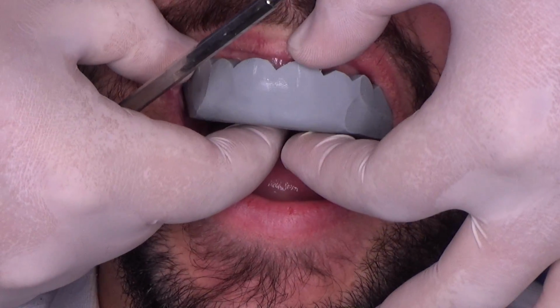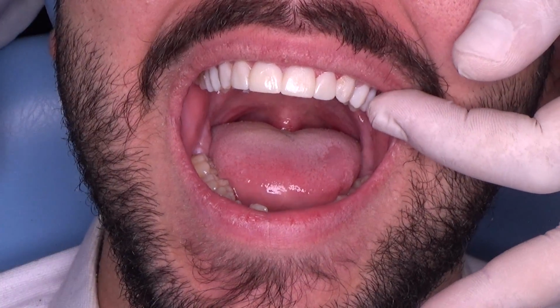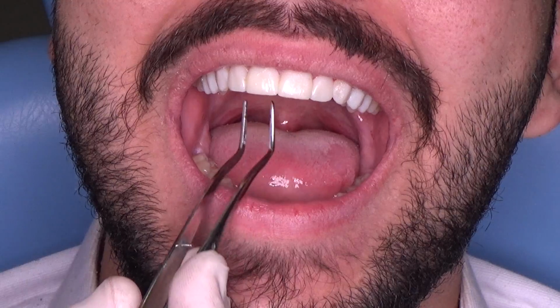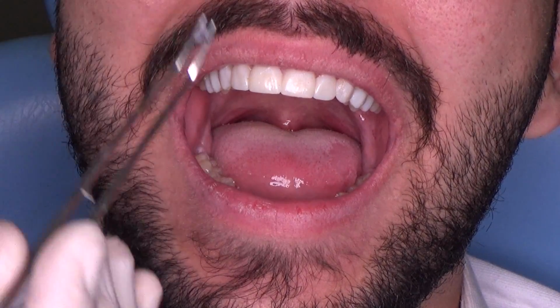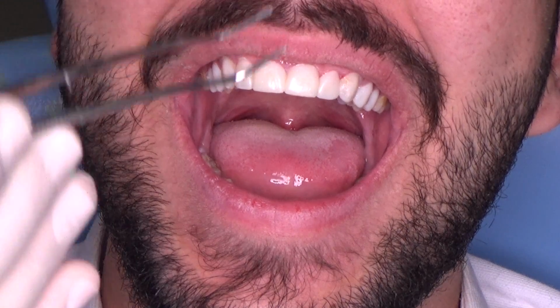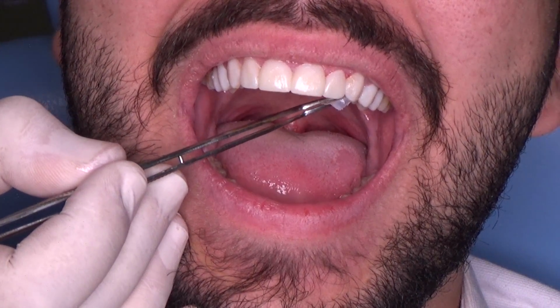And now the big moment. I hope everything will fit. Oh, I'm happy. I hope you're happy too. And I have a happy patient, so everything is fine. I will remove the palatal access, you see, very gently. Otherwise you can break all the aesthetics.